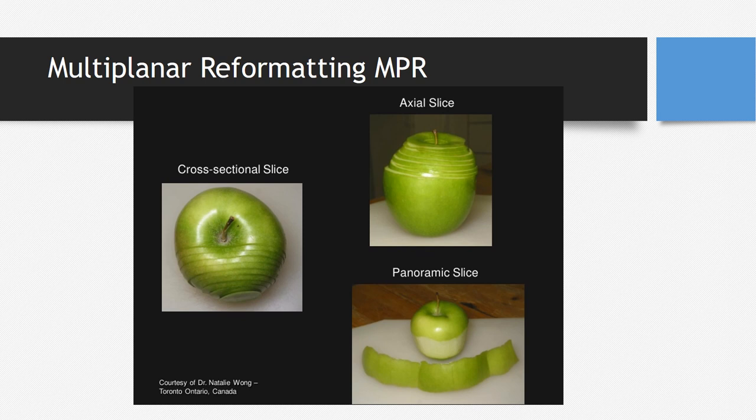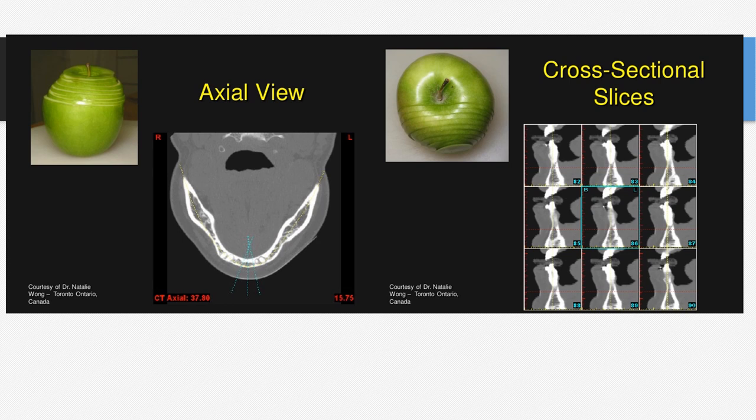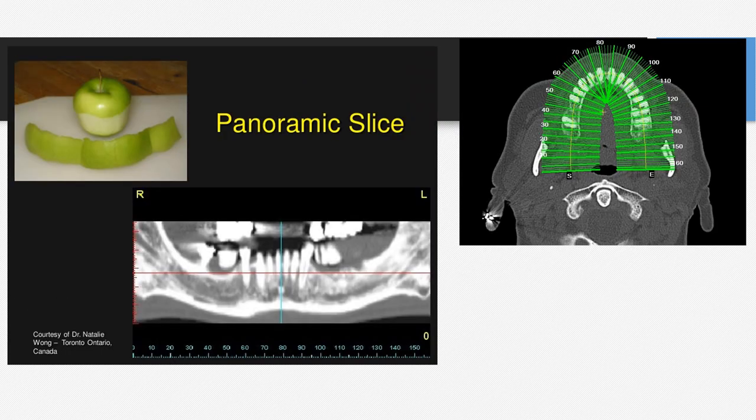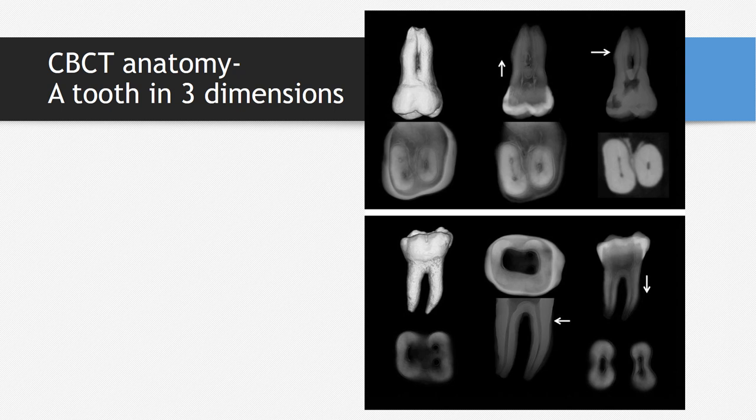The panoramic slice is either generated manually or the CBCT software does it for you based on the chosen site, making it virtually similar to looking at a panoramic radiograph after 3D volumetric imaging. CBCT also gives you 3D anatomy of a tooth — this example of an extracted tooth shows details of the pulp, pulp chambers, root morphology, and crown morphology in much more detail, visible from all different planes.